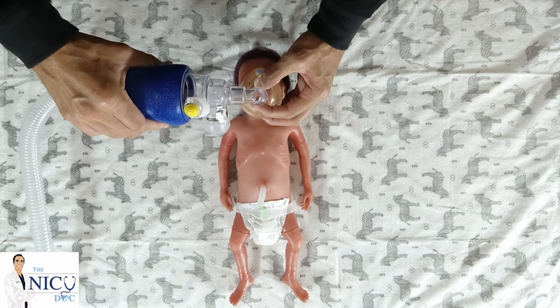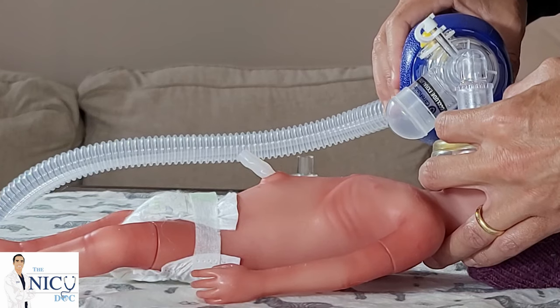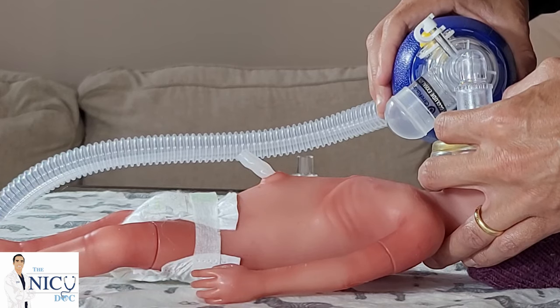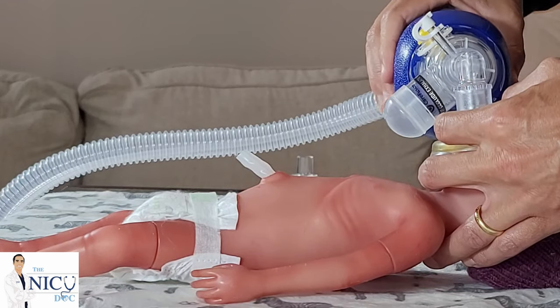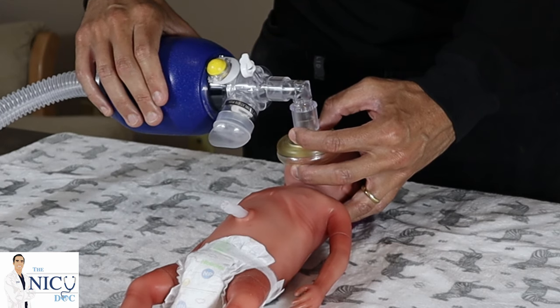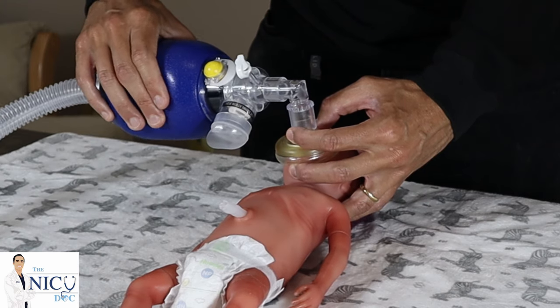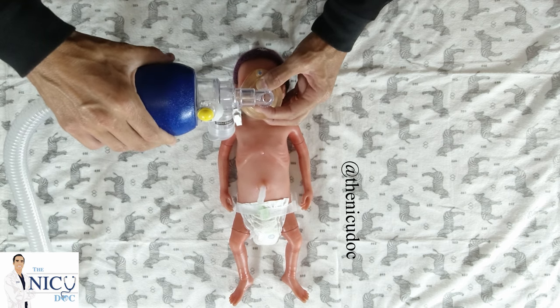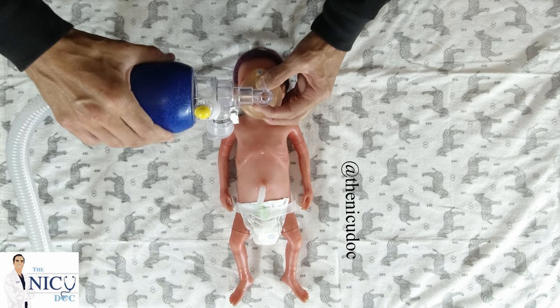For an older baby, use a longer inspiratory time. Always watch for that chest rise. If the baby is spontaneously breathing, try as best as possible to coordinate the baby's breaths with the air you are pushing in — coordinate your pressures as the baby takes their breath. Look directly at the chest to make sure you're getting those breaths. If there isn't a good seal, you may look like you're pushing air in but you will not see the chest rise.